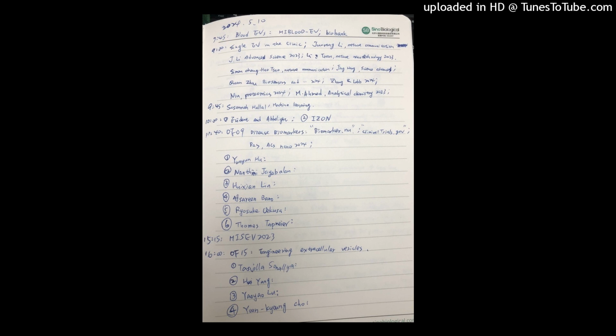And for example, what we saw with the microRNA is that even a concentration of platelets 100-fold below the concentration that can be detected by a routine hematology analyzer disturbs the microRNA measurements of vesicles. Yeah, perhaps then you can say that if the platelet concentration is above a certain threshold, you should not use these samples for microRNA analysis.